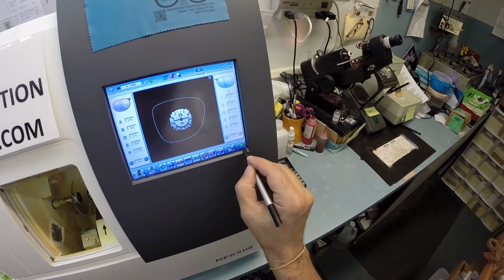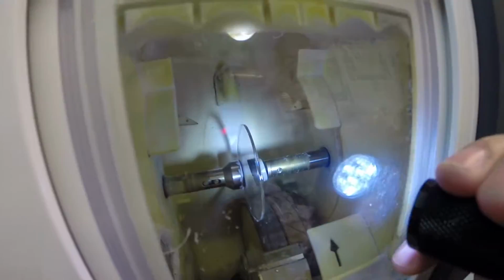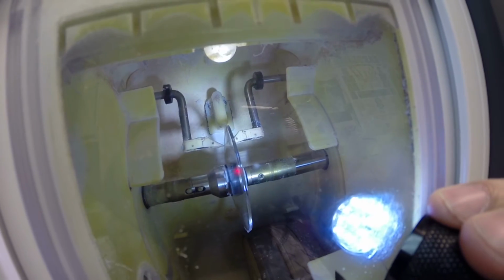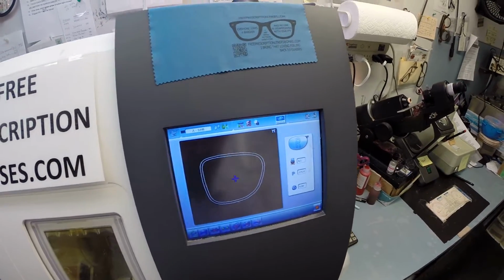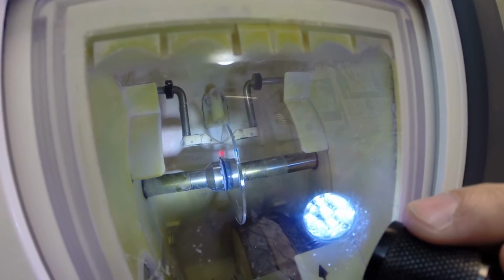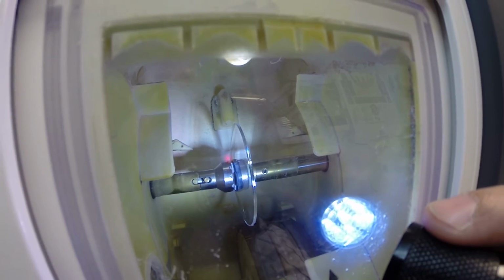I'm going to hit the green arrow, which is start in every language. The door closes, the clamp shuts. And then the lens is going to be traced by two white styluses, making sure that it's large enough to fit into the frame. And it is, you can see as it's going around, tracing out the shape. And then the old carpenter saying, measure twice, cut once. It's measuring the thickness of the lens at every point to know exactly and precisely where to place the bevel so you have the least amount of edge thickness showing.